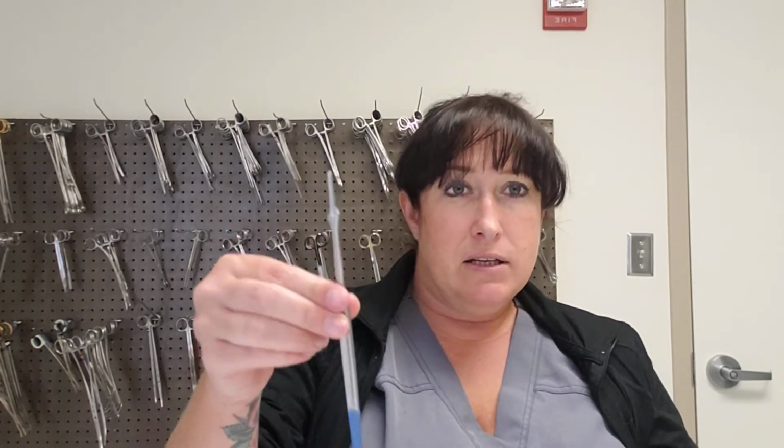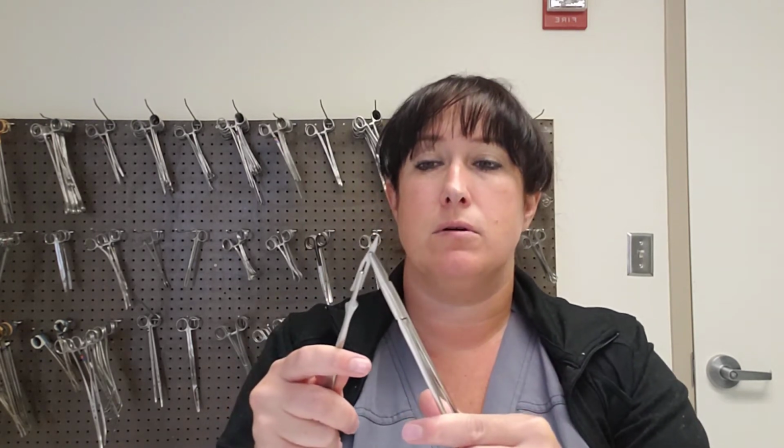So the sharpness is right here, and of course the point is very sharp. Now, even though this 11 blade will fit on your number 3 knife handle, your 3 long knife handle, or your 7, what I would say the most appropriate place for it is going to be your 7. And it's easy to remember because it's like 7-11, like the convenience store. And of course you will just load your thing up, as mentioned before, like so. You've got your 7-11 scalpel.